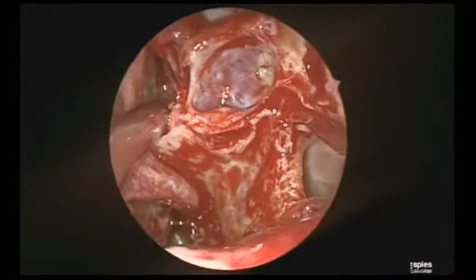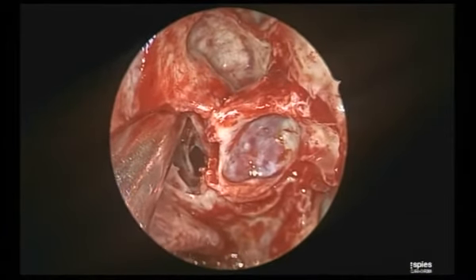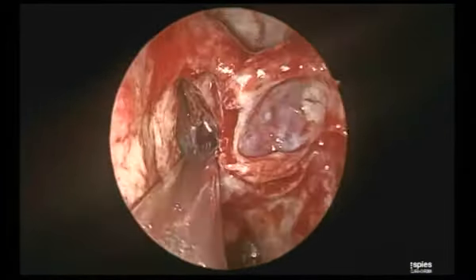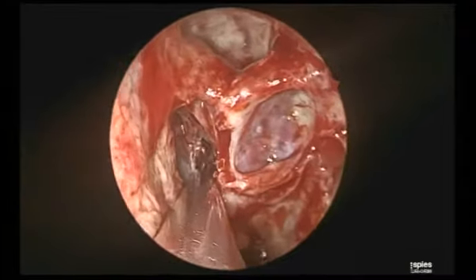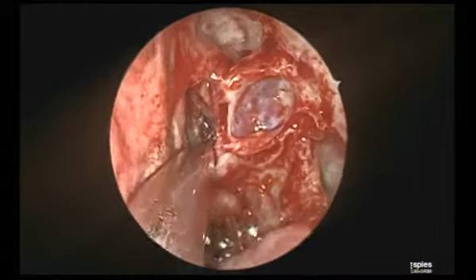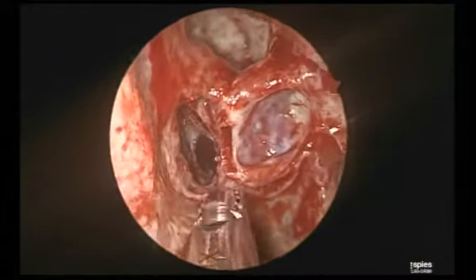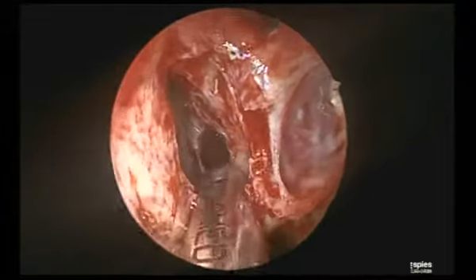If I don't follow the maxillary line and try to look for the sphenoid sinus here, I will be in the cranial cavity. Yes, that's my point. Perfect. What I am showing is the safest way for the junior. So the clinician identifies the sphenoid ostium and widens it to its maximum limits, more so inferiorly, correct? First medially, medially and inferiorly.